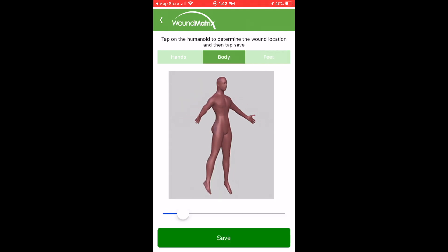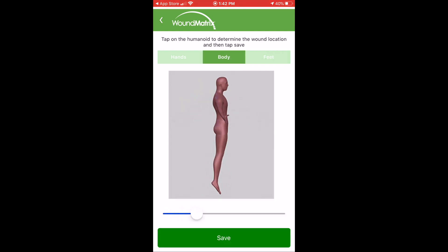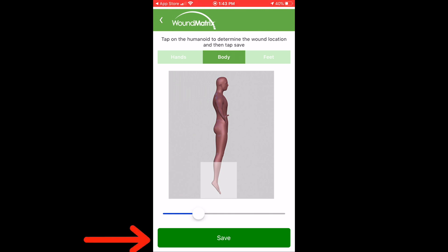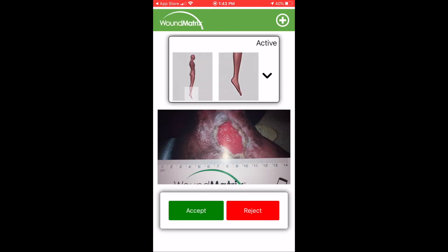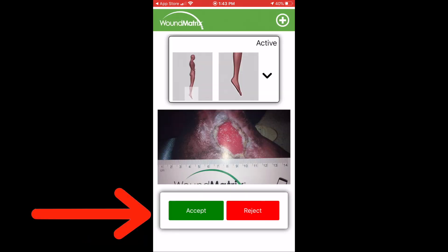Tap on the correct body part that matches the location of your wound picture. Tap Save. Tap Accept.